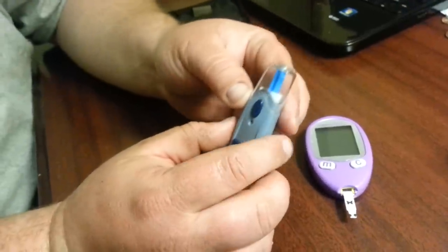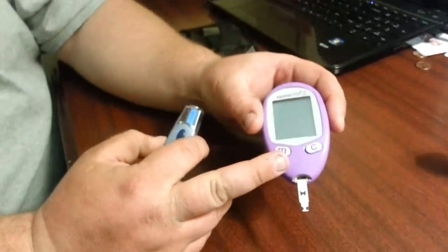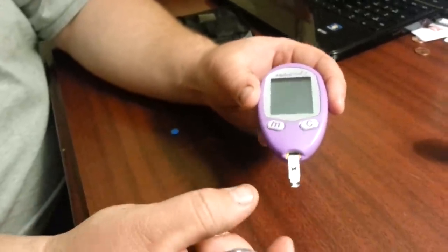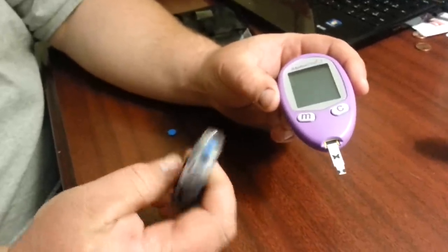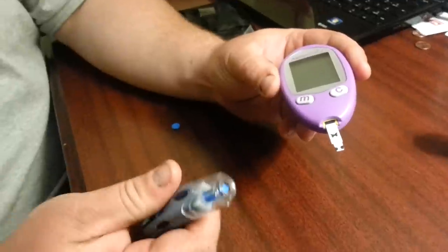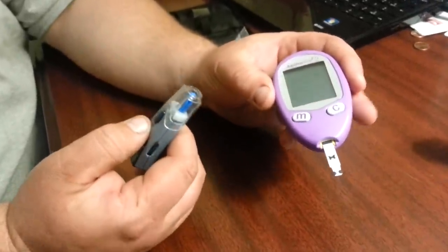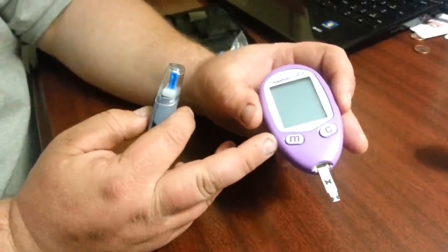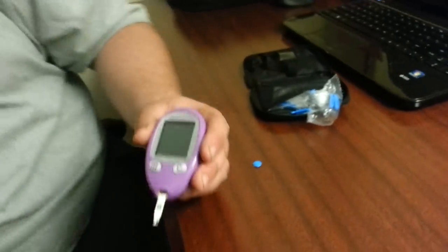The lancet is ready to go. Now take your glucose meter and test strip. I have the test strip slid in just a little bit so it doesn't turn on yet, giving you time in case you don't get a good prick the first time. This helps you get ready because sometimes when your dog hears the clicking sound, they know they're almost done — so if you're reaching for the meter, the dog might get up and you'll lose your blood spot and have to do it all over again.